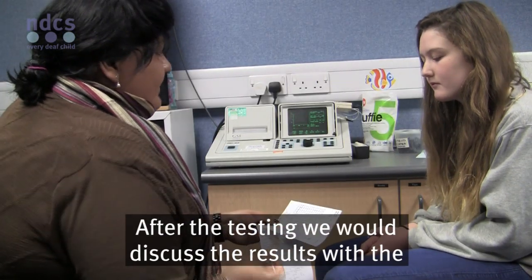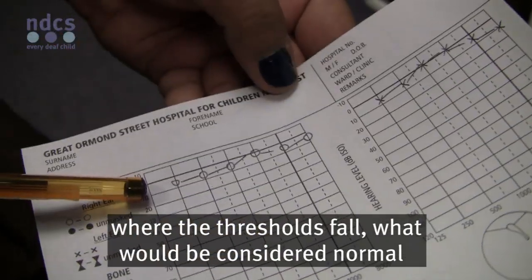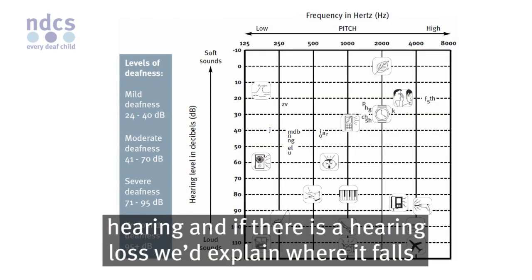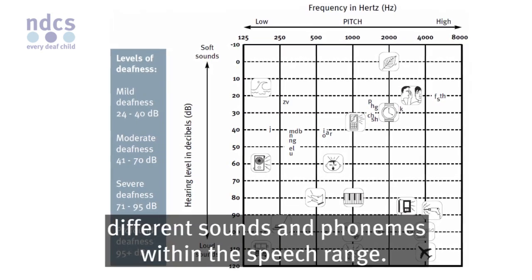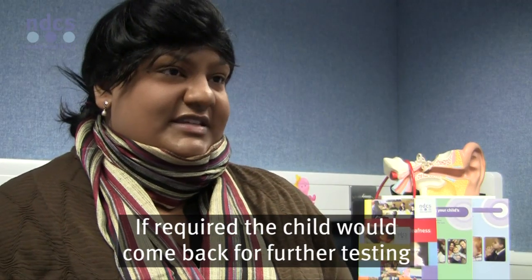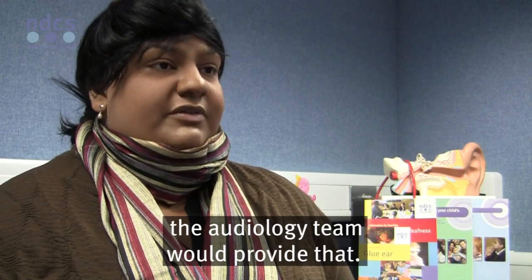After the testing, we would discuss the results with the parents. We would explain the hearing test results, explain where the thresholds fall, and what would be considered normal hearing. If there is a hearing loss, we'd explain where it falls within what we call the speech banana, which identifies different sounds and phonemes within the speech range. If required, the child would come back for further testing, and if there is a need for hearing aid provision, the audiology team would provide that.